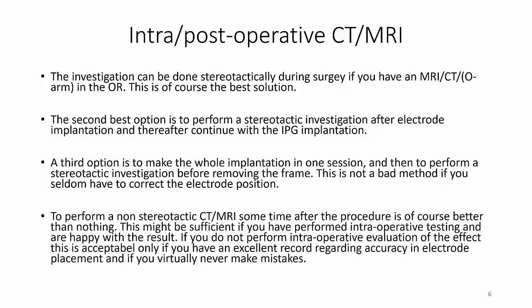To perform a non-stereotactic CT or MRI sometime after the procedure is of course better than nothing. This might be sufficient if you have performed intraoperative testing and you're happy with the result. If you do not perform intraoperative evaluation of the effect, this is acceptable only if you have an excellent record regarding accuracy in electrode placement and if you virtually never make mistakes.